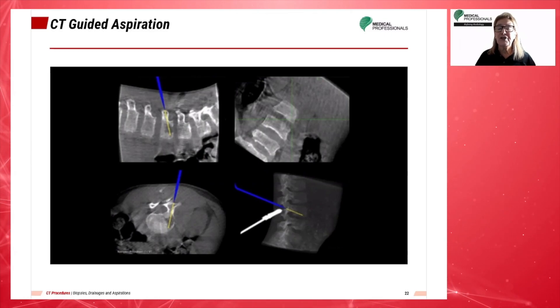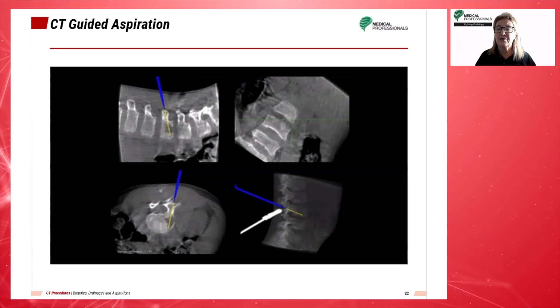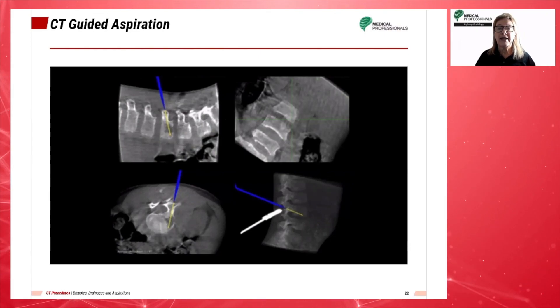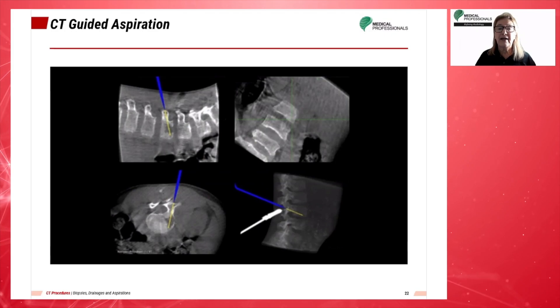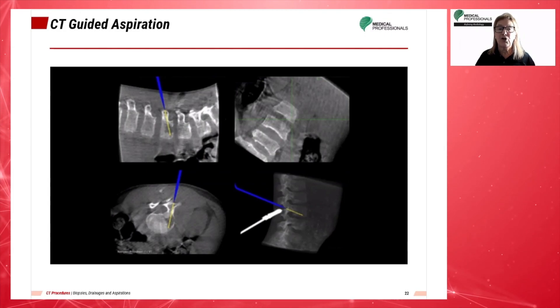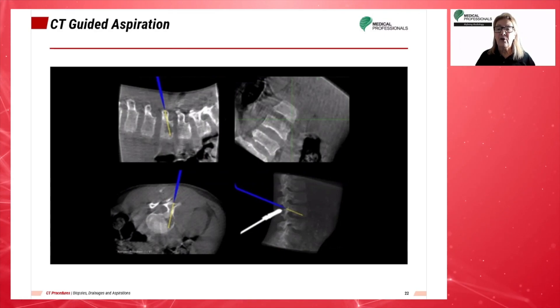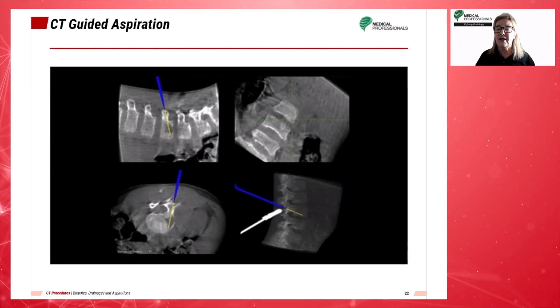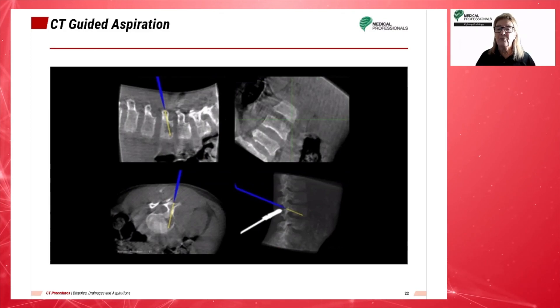The procedure is considered simple and safe to perform with few complications. These images were obtained during a CT-guided aspiration biopsy of L3 on an 11-year-old boy. This is a case of vertebral osteomyelitis of L3 caused by methicillin-sensitive Staphylococcus aureus, or MSSA, after the completion of the CT-guided aspiration biopsy of the vertebral body of L3.